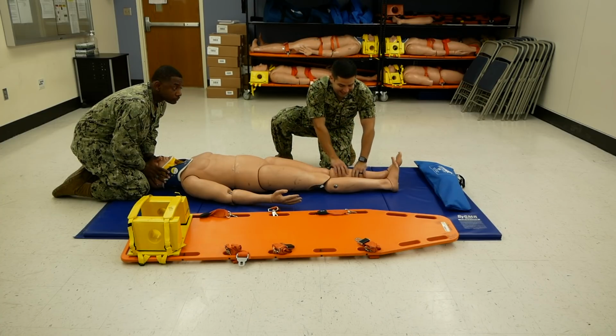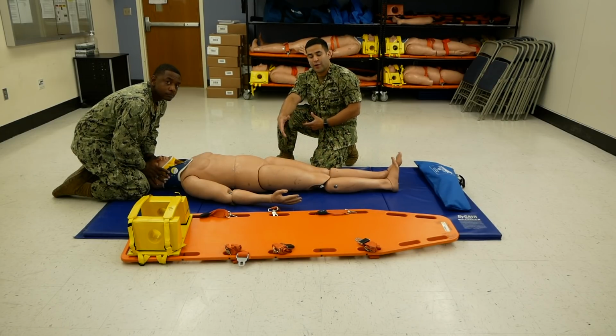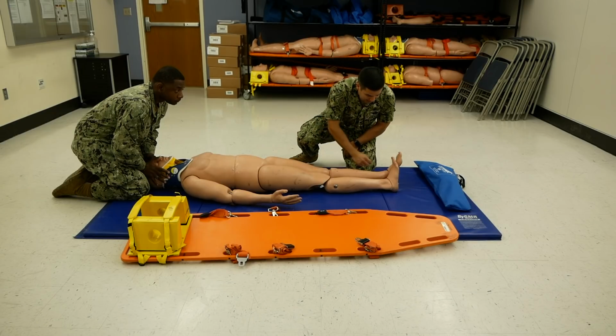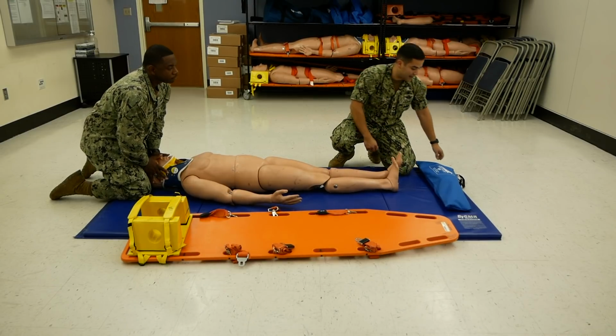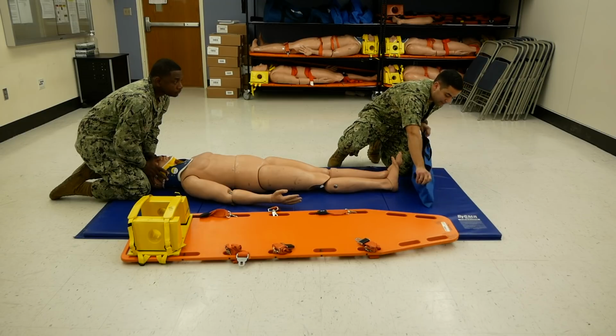Doing the washrag technique, checking the lower extremities. On this scenario, we come across a fractured femur. So we want to apply a traction splint to this fractured femur. What you want to do is assess distal circulation, check cap refill and CMS, and then go ahead and apply the Sager traction splint.